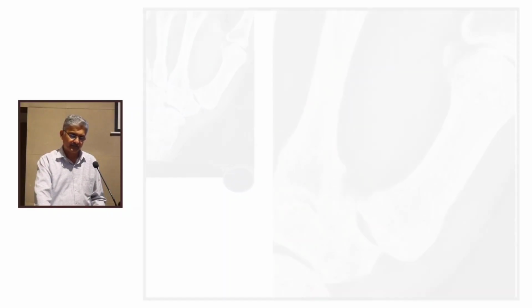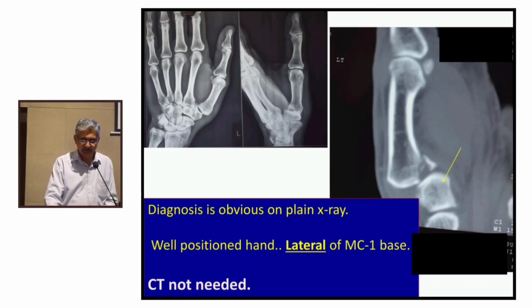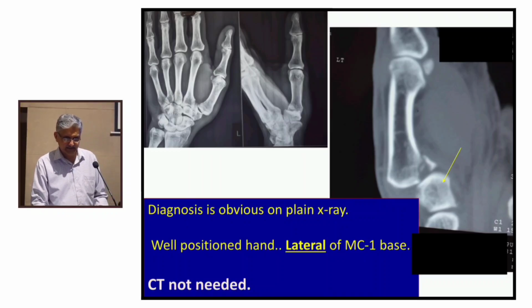So sure enough, a CT scan is obtained, and what you notice, this is the trapezium, the metacarpal is shifted out because of the effect of the abductor pollicis longus, and therefore this is the malunited metacarpal 1 base, and this requires surgery, because new bone has formed in more than a month's time.